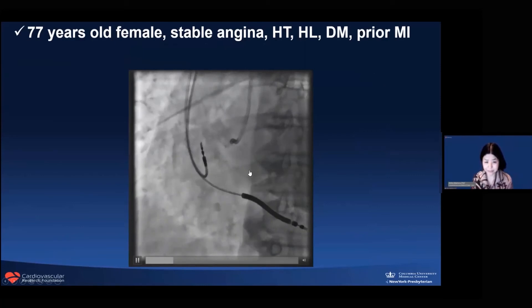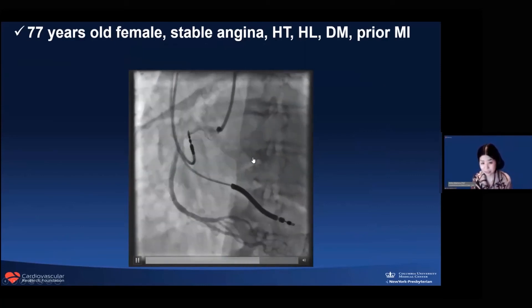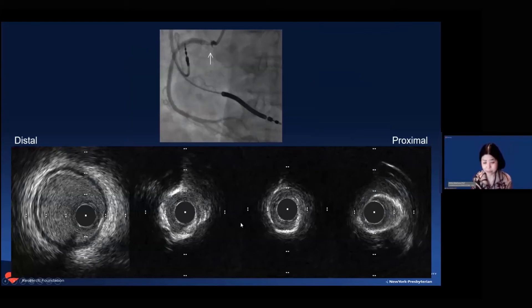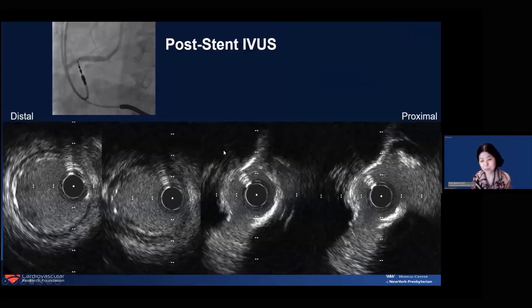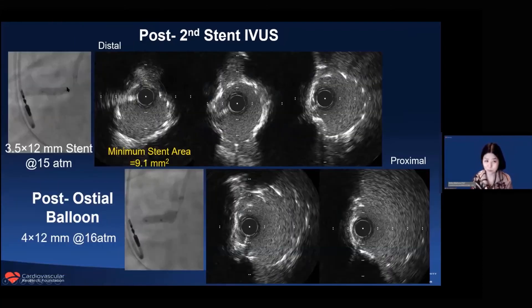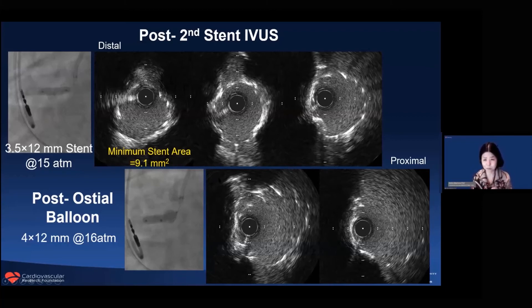Ostial lesions are very important. In this case, the ostial region is visible, and the operator identified a very clear focal calcified stenosis by IVUS. The operator placed the stent angiographically, and it looked okay. But when we reviewed the IVUS, we were surprised—the region was completely missed and there was no stent at the ostium. The operator placed one more stent ostially flush. It's very important: even though angiographically you think the ostium is covered, sometimes it is not. Always confirm you have covered the entire lesion after disengaging the guiding catheter.